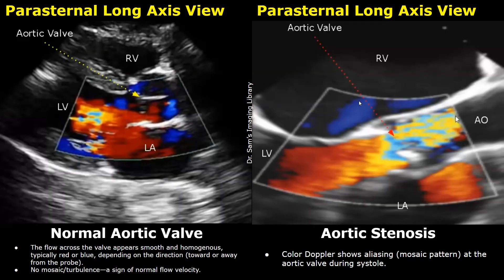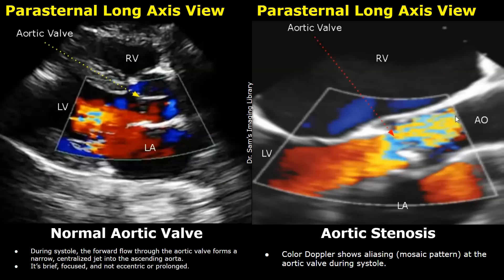We will compare the normal aortic valve image with aortic stenosis. On the left, we have a normal image with color Doppler applied. With the help of color Doppler, we can determine if the blood flow across the aortic valve is normal or disturbed. Normally, the color Doppler will show a single color — either red or blue depending on the probe position — indicating smooth and homogeneous flow across the valve. During systole, the forward flow through the aortic valve forms a narrow, centralized jet into the ascending aorta.